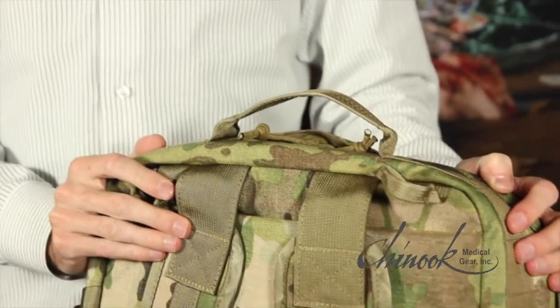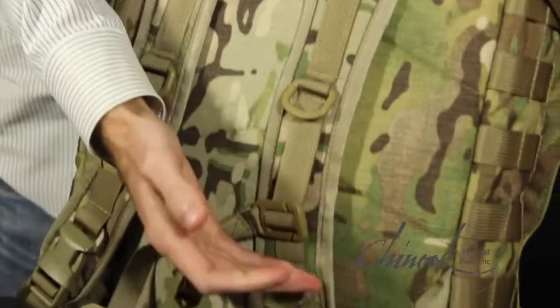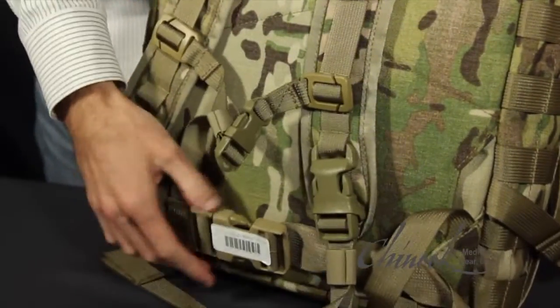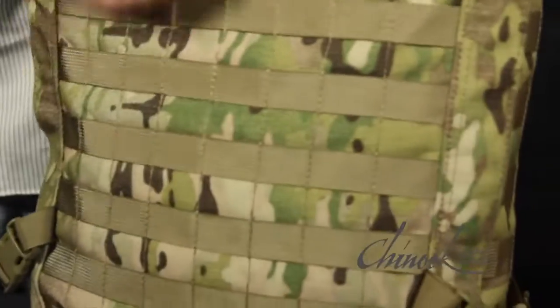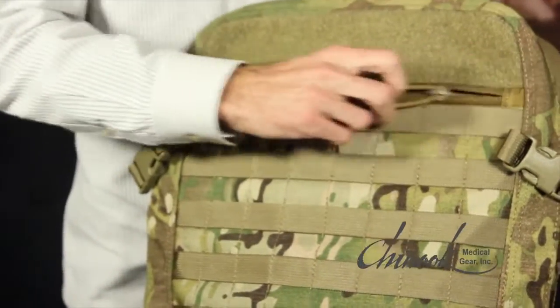The outside of the pack features a carrying handle, shoulder straps, chest and waist straps, and multiple rows of PALS webbing. There are also four compression straps and an outside zippered pocket.